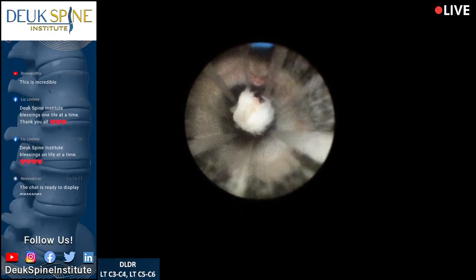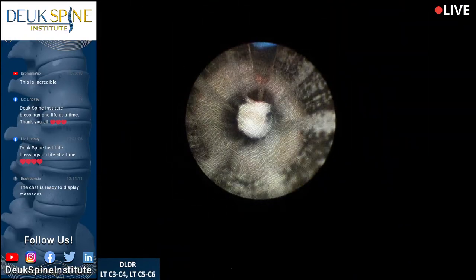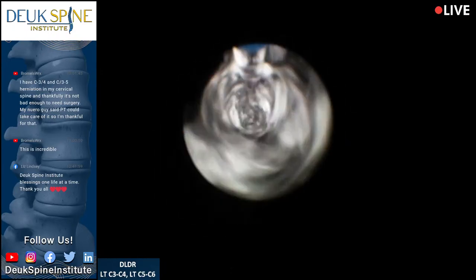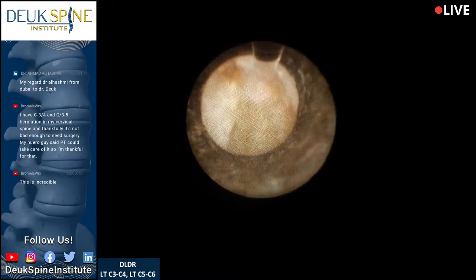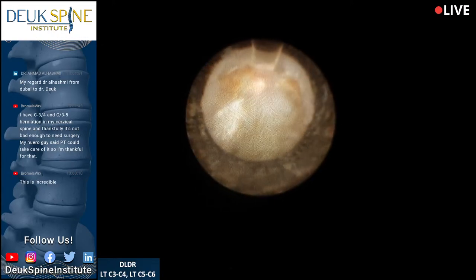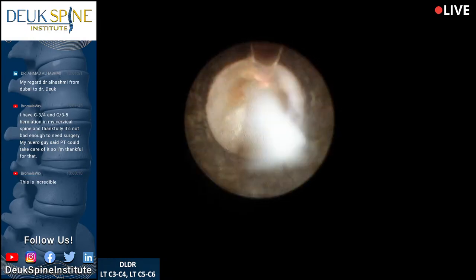There's a piece of herniation — I'm trying to float it out but it's pretty dense, sitting at the bottom of the water column; I'm using hydrostatic pressure to push it out the tube. For those who don't know, I'm a neurosurgeon. I've been trained to do artificial discs, fusions, and laminectomies — I did those surgeries for many years until I discovered the endoscopic technique from overseas. Once I saw how minimally invasive it was, my focus was just on getting it to work. The Koreans had done a good job getting it to work for arm pain and radiculopathy, but they could never solve the neck pain or headache issue — however, I did.